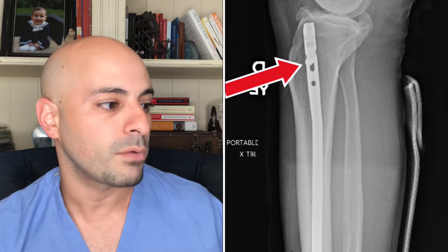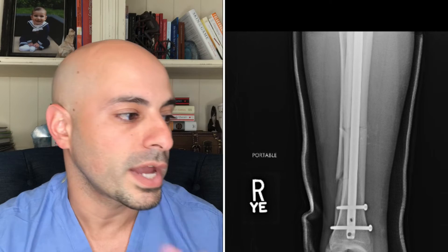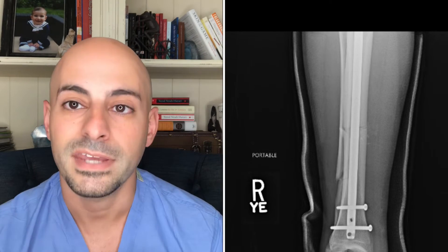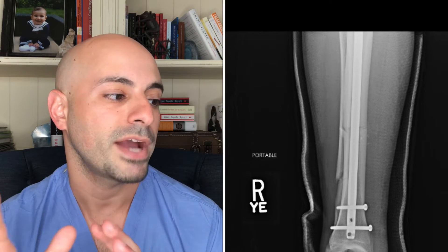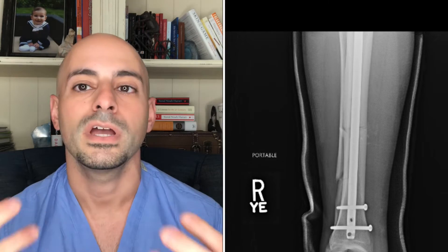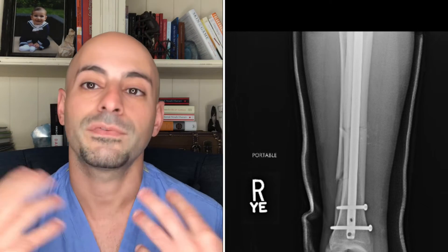Let's go lower and back to the AP view. We can see the nail going across the fracture site. This fracture site seems to be lined up pretty well on the tibia and on the fibula. You can still see there's a fracture there, but because the tibia has been well aligned and because the fibula fractures in the shaft — the middle portion of the bone — we do not need to stabilize it; it will heal on its own as long as the tibia is stable. Looking down here, we can see two screws placed underneath the fracture site, which is very common.